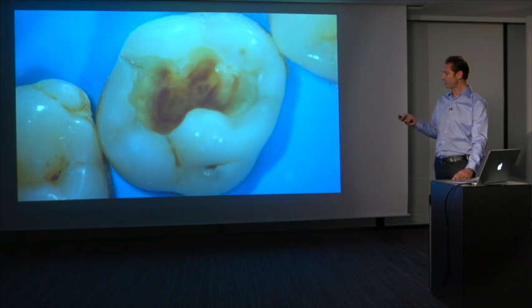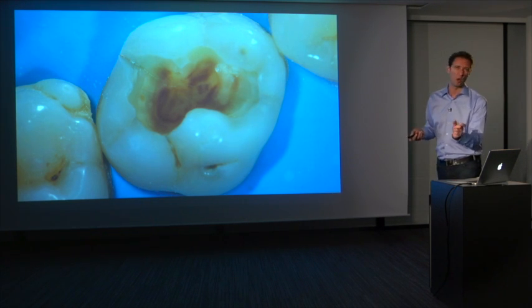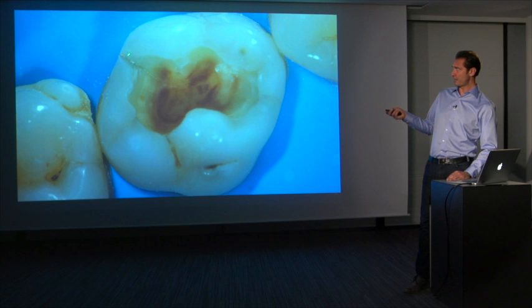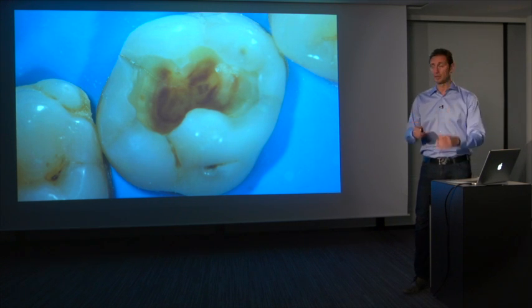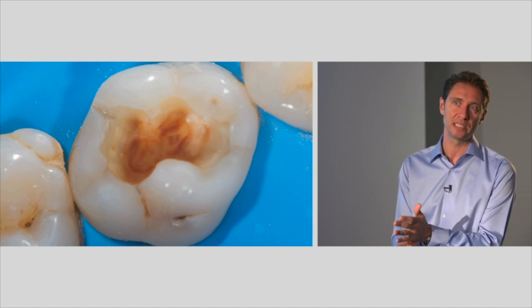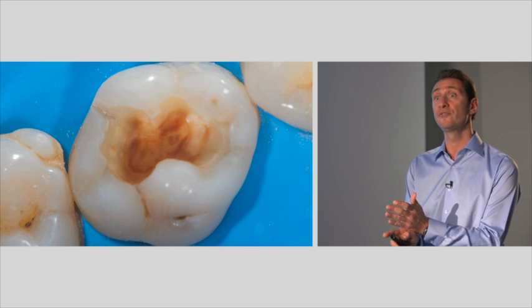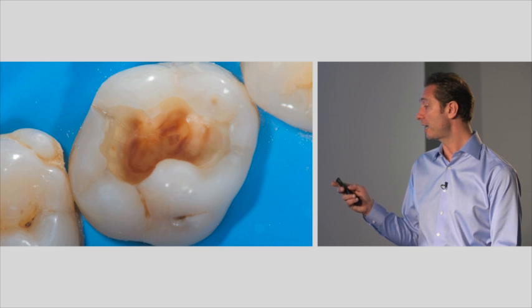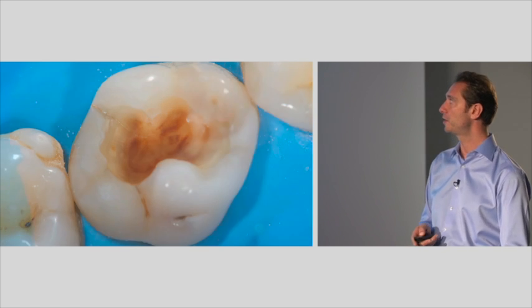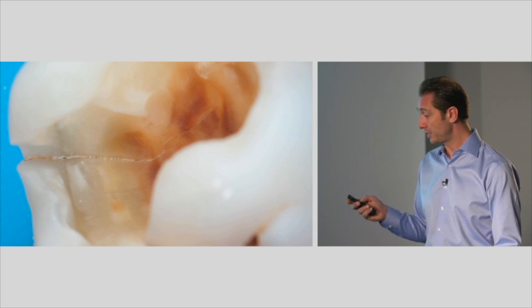You see the fracture line here, which is pretty deep, which is pretty wide. So I needed to chase it down to this area to be sure that I was able to seal it off. I need to be sure that I have a margin that can be sealed off. I should not allow any infiltration there. So I should absolutely chase it down until the area where I see no infiltration anymore. So here you can see it in detail.